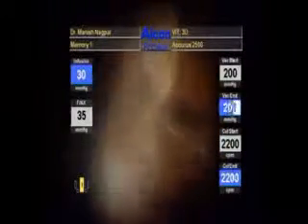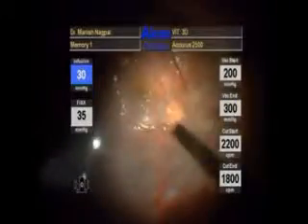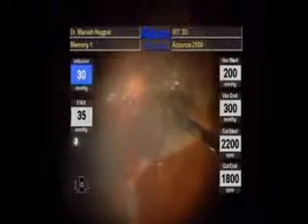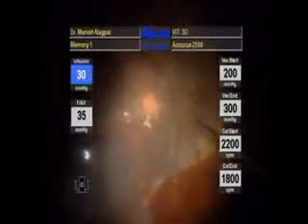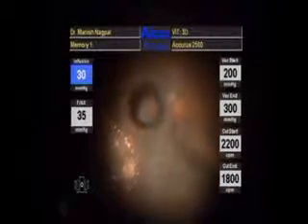Traction is identified and a radial retinectomy is done to relieve the same. Residual folds on the retina are ironed out with a spatula. Once the retina is flat, a 360-degree endolaser barrage is carried out.